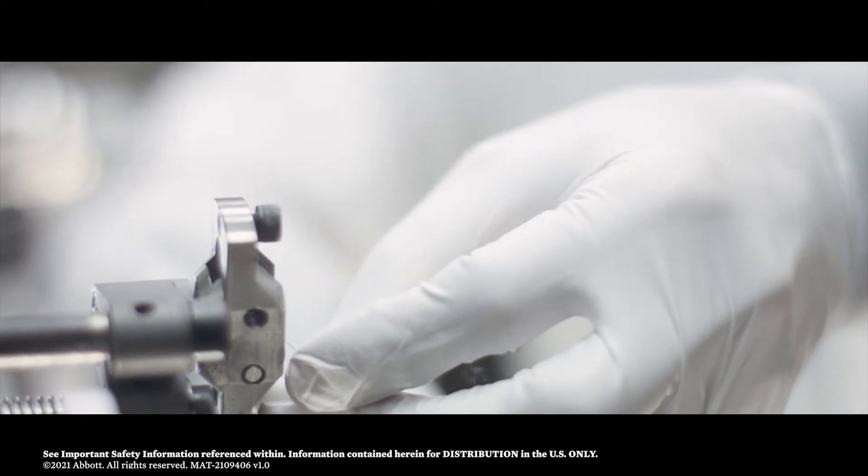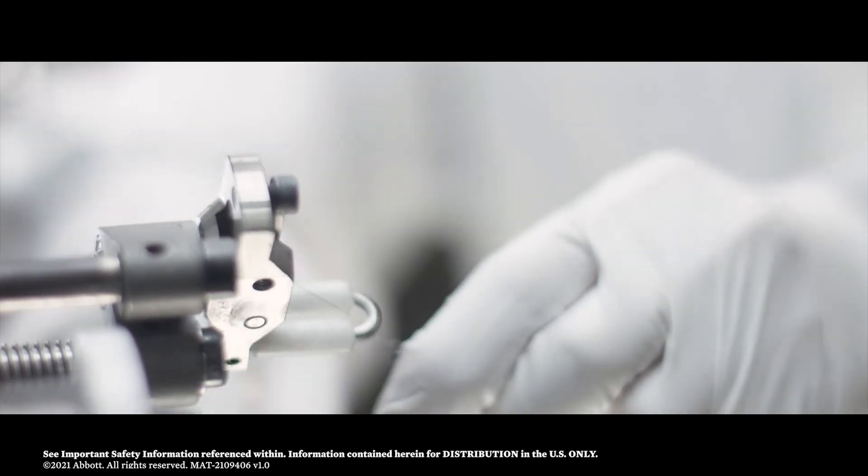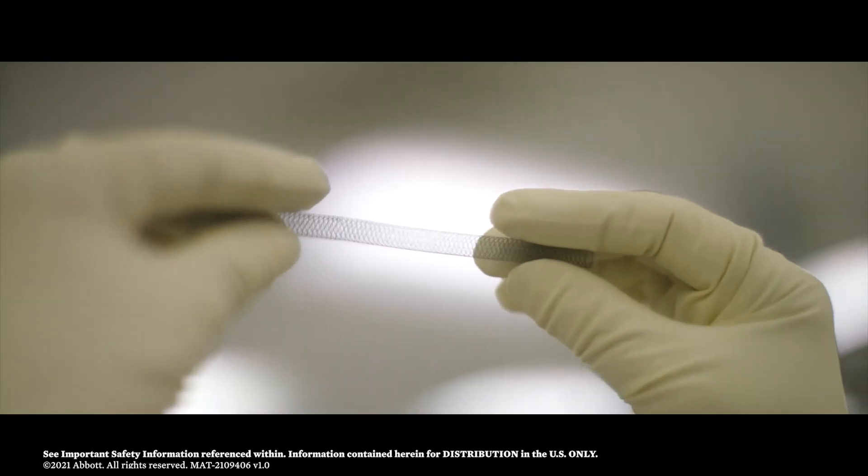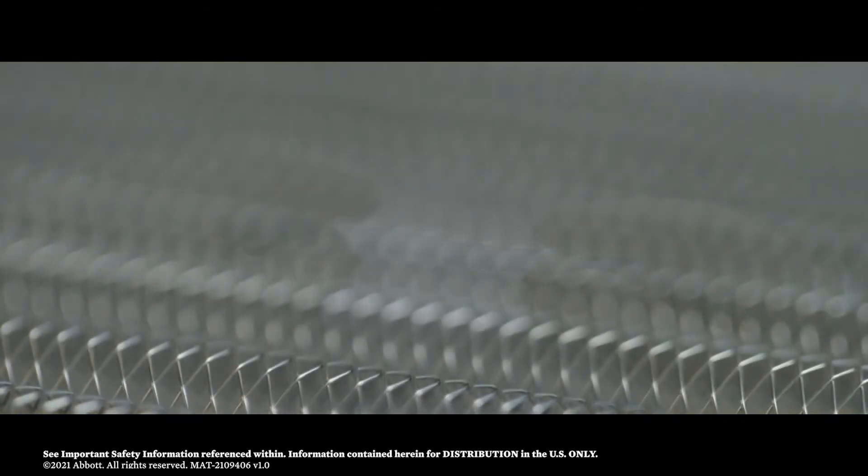Once the stent length is achieved, the loose nitinol wires are individually back braided and the ends are carefully connected. The Supera construction process is completed with no additional nitinol removed.